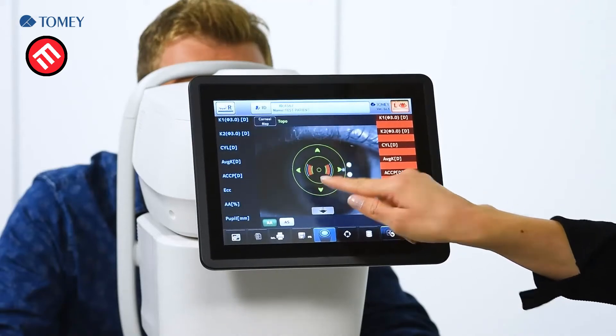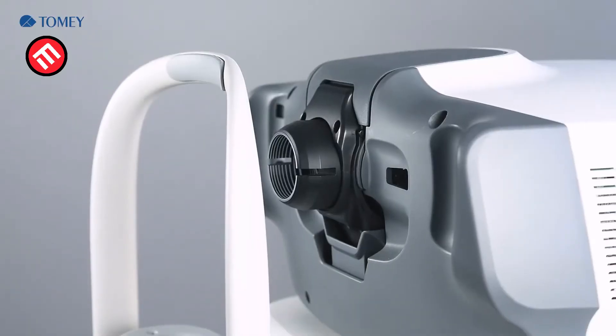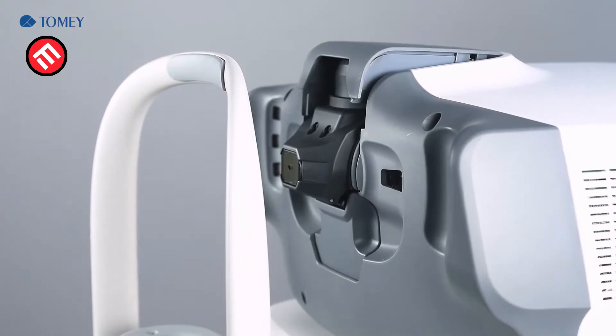For the measurement of the different examinations, the system uses two different cones. One is the cone for refraction, keratometry, topography, and also the dry eye function. The second cone is used for tonometry and pachymetry.